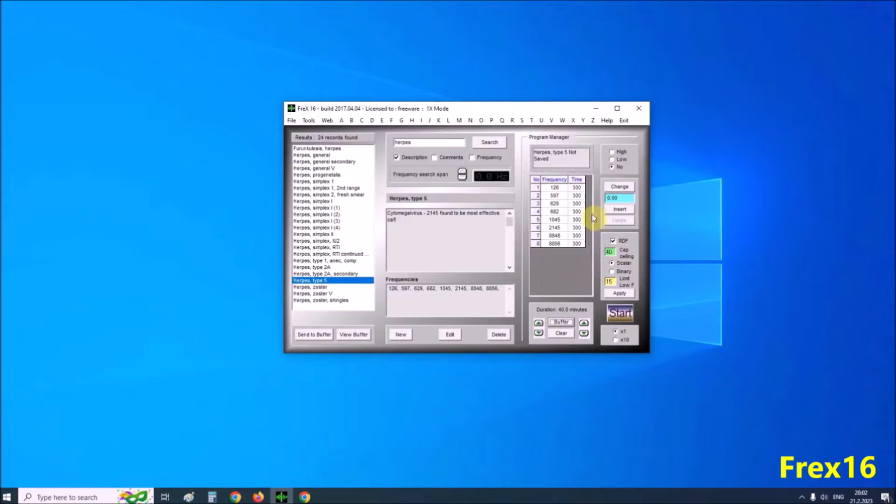We can change the duration of each frequency. For example, 100 seconds. Or 50 seconds. Another very useful function is that we can assign our own frequency sequence which is not contained in the given database.